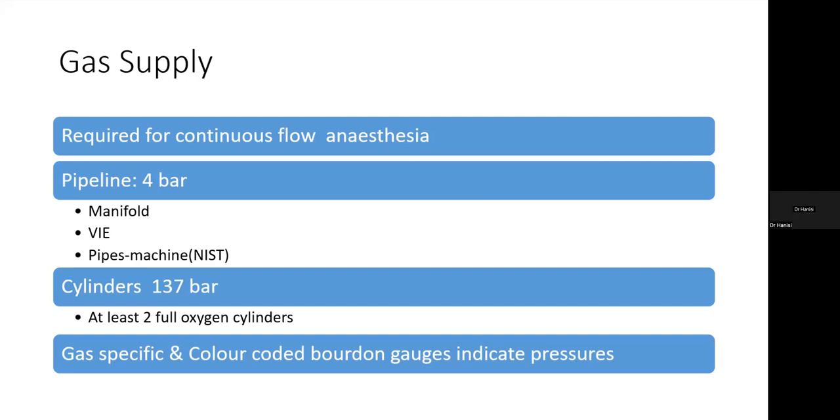Dr. Anis, we said for overuse, because the oxygen which is released gets very cold, the more you use it, the colder it becomes. So you have to actively warm it up, or otherwise the oxygen will get to the patients very cold. That is from overuse.